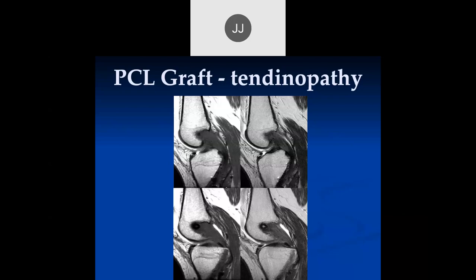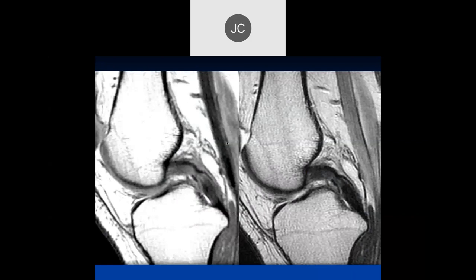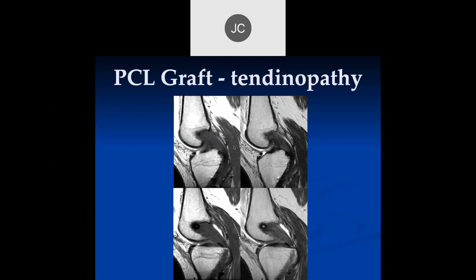You can get tendinopathy of both the native as well as grafts. We'll talk about the details of the grafts when we get to a later section where we'll talk about the different ways to put in the PCL graft and the potential problems with each of the different techniques. There are many - and that means they're all not that good.